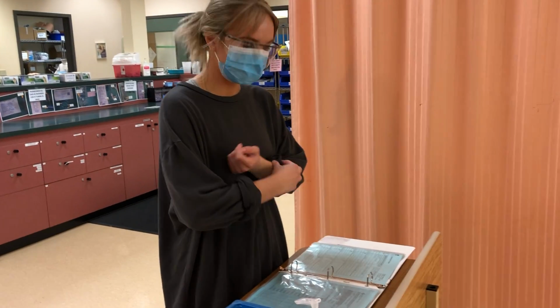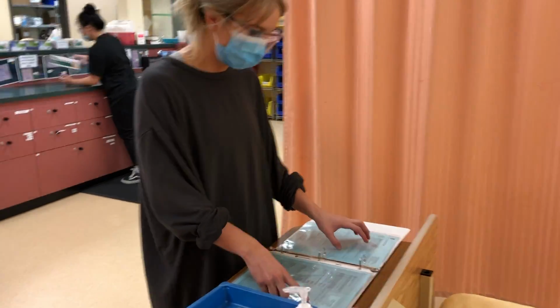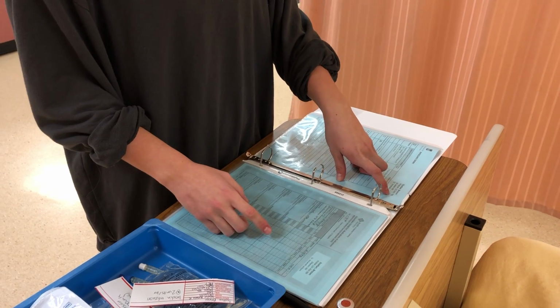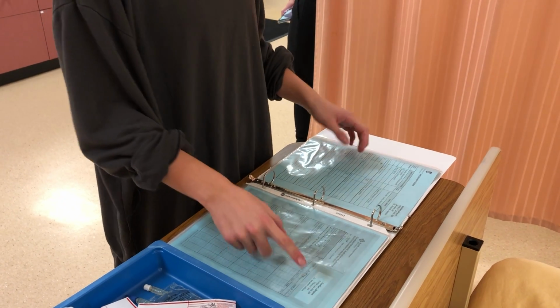Okay, so we're doing an insulin infusion, and I'm just going to first compare the physician's order against the MAR. So we have Scotland Bryson, Finn 1, 2, 3, 4, 5, 6, 7, 8, 9, 1, 2, 3, 4, 5, 6, 7, 8, 9, 24 years old.